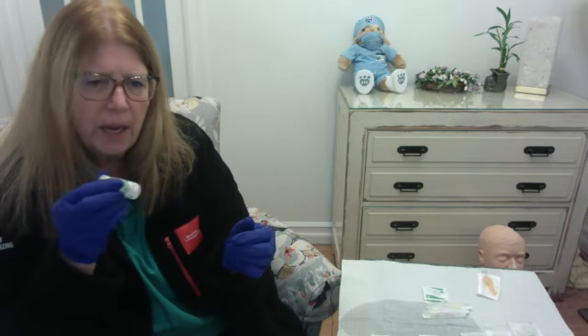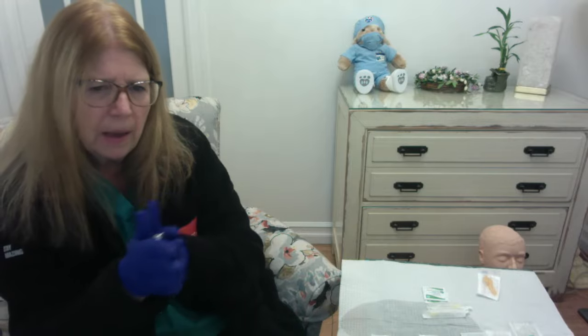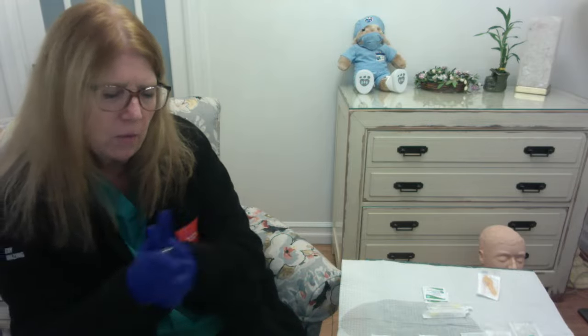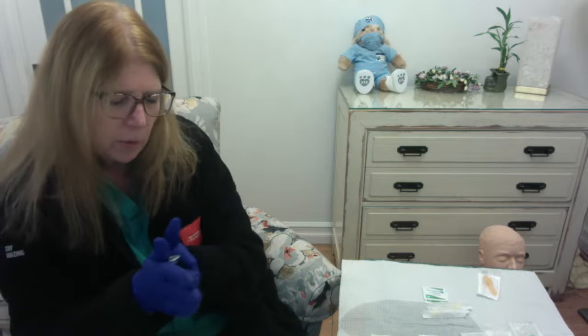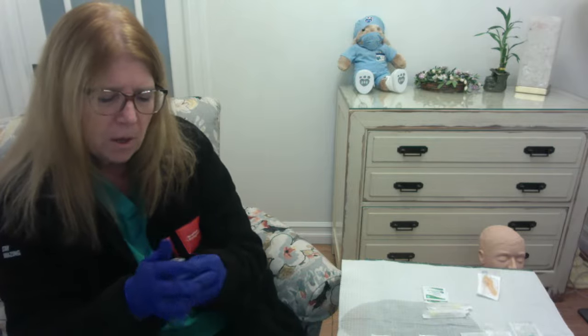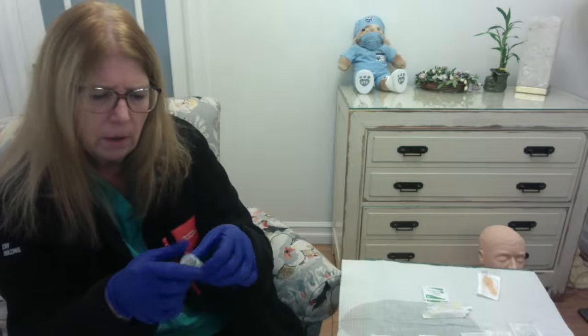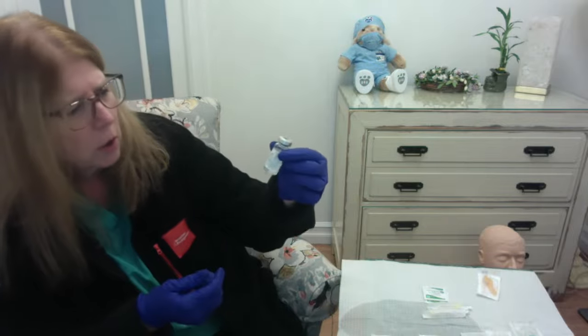We never do any kind of shaking. We just simply want to roll it back and forth. Okay, back and forth, because we have to make sure that all of that powder has been dissolved by that diluent. Okay. We can also do a little sort of flipping like this. Okay, and then I'm going to take a look through my window.